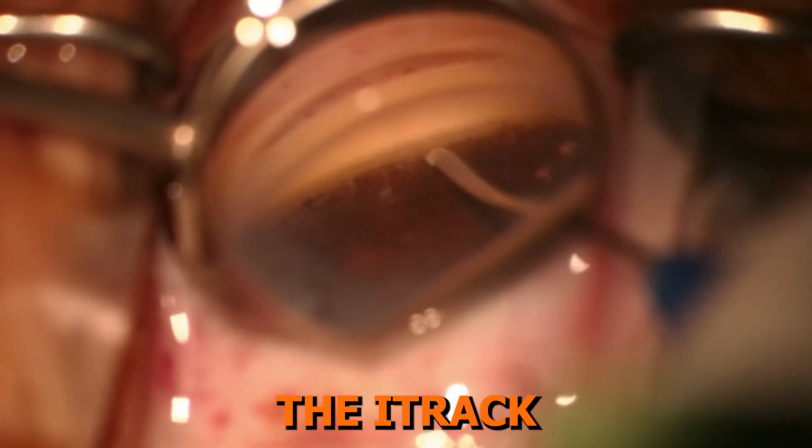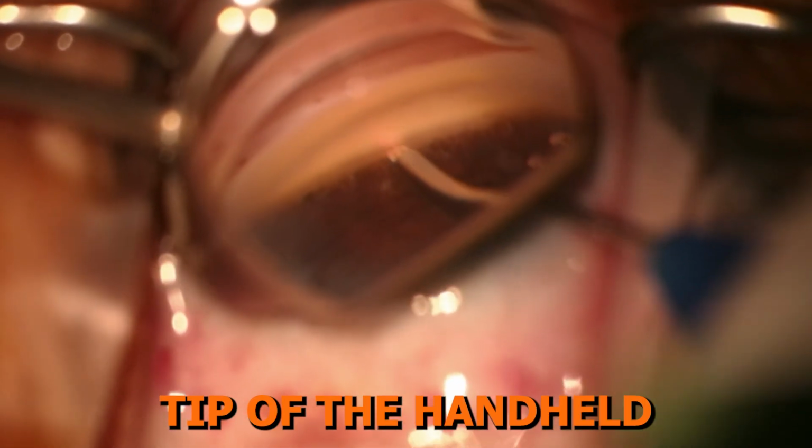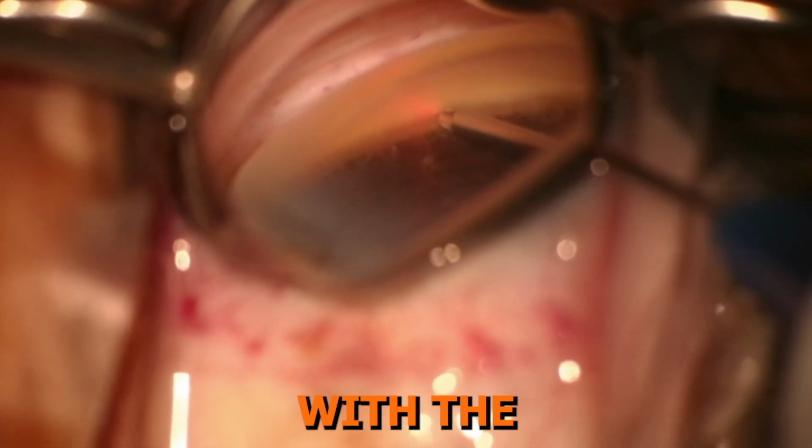Let's watch the iTrack Advance in surgical action. The surgeon uses the cannula tip of the handheld injector to pierce the TM and rest against the scleral wall, parallel with Schlemm's canal.